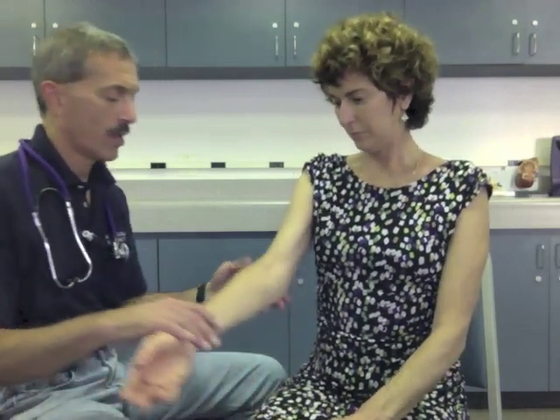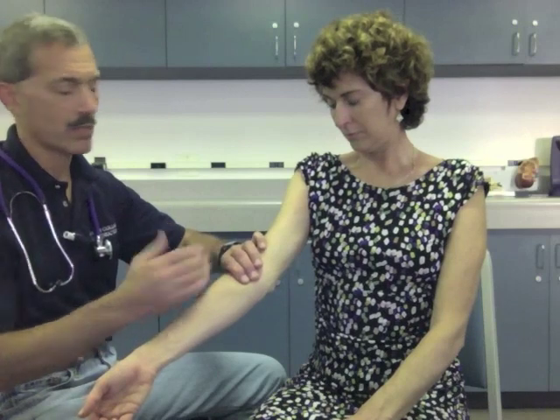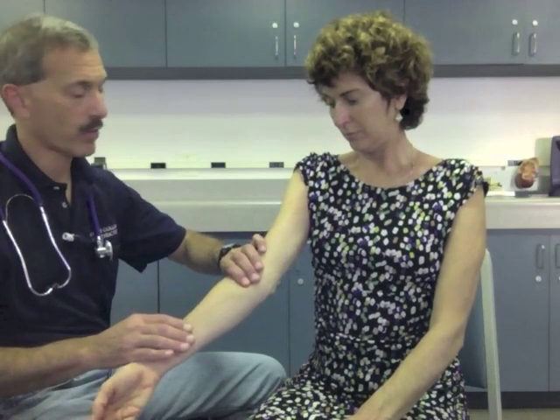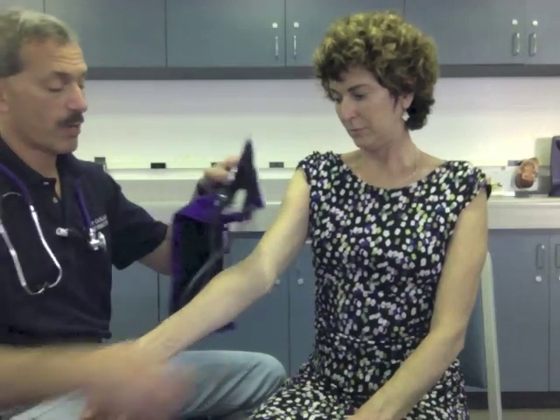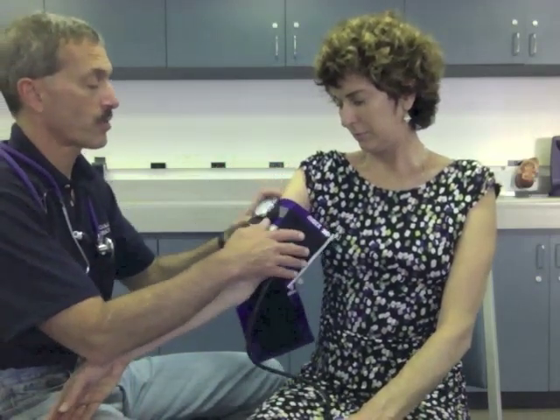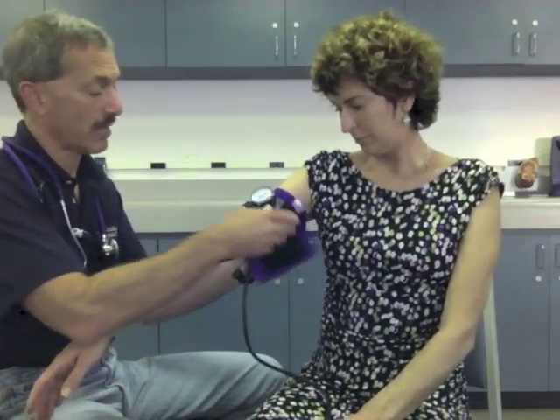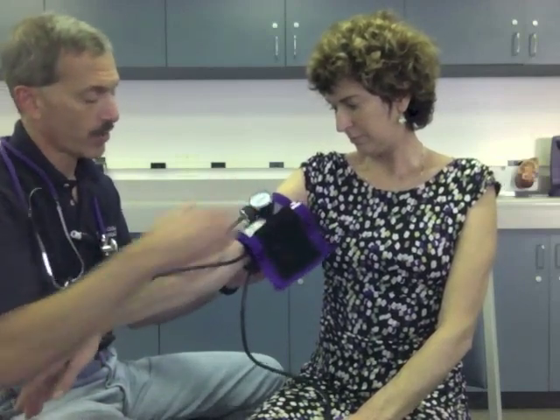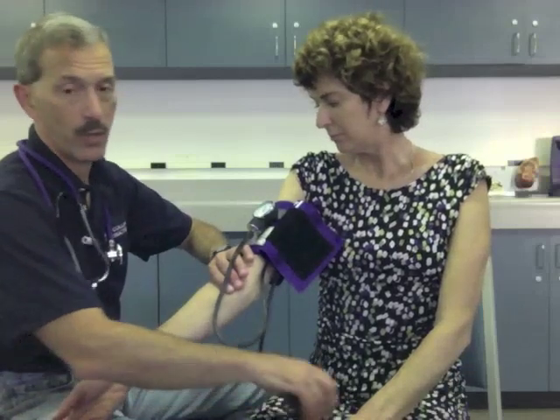Next I'm going to obtain her blood pressure. First I'm going to start by getting a palpated blood pressure. I want to gently lock her elbow to draw the artery up to the surface. I'm going to locate her brachial artery on the medial side of her antecubital space — good strong brachial artery. Next I'm going to apply the BP cuff, placing it over the arm making sure it covers approximately two-thirds of the patient's arm, and that it's nice and snug.